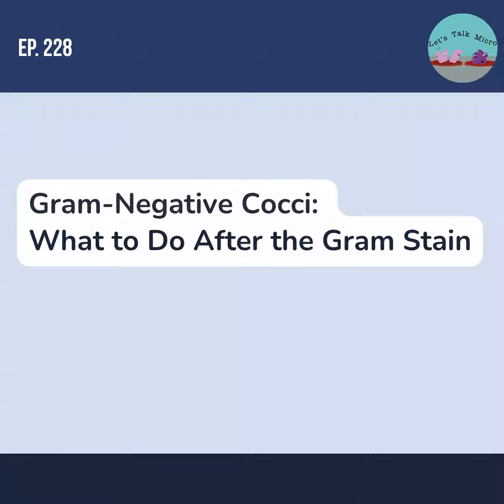And of course, those of you that work in a lab, you know that sometimes microbiology is more centralized and maybe there's one hospital that serves as the micro lab for many. Maybe the one that you work in, you don't do cultures, like you don't set them up, you don't read them. So sometimes there might be a delay in your sample being transported to that microbiology lab. And this is what the system is for, right? If the sample is going to take longer than 24 hours, it gets collected in this and it should be transported as soon as possible. But even if there are delays in the system, at least you're providing the right conditions from the beginning.